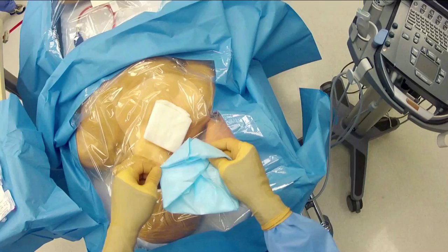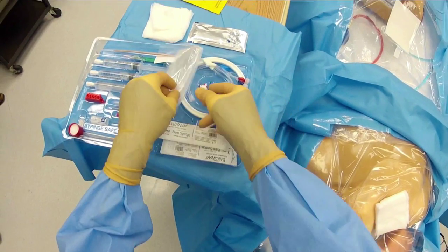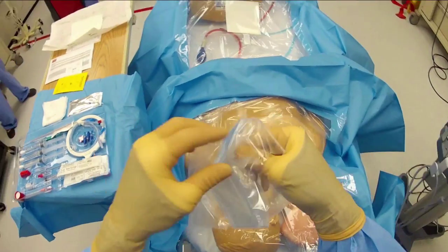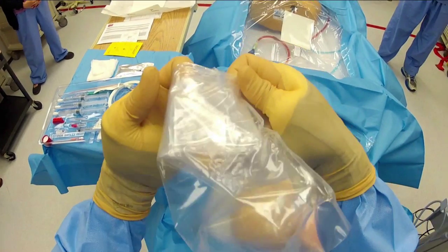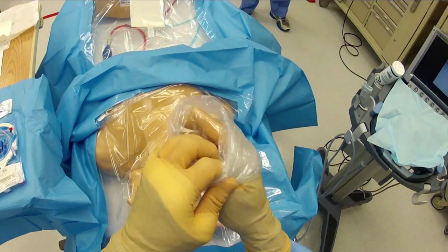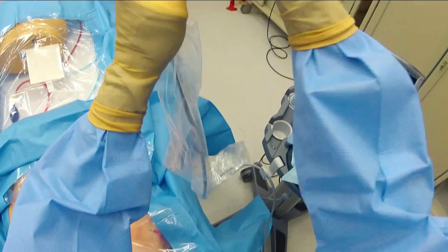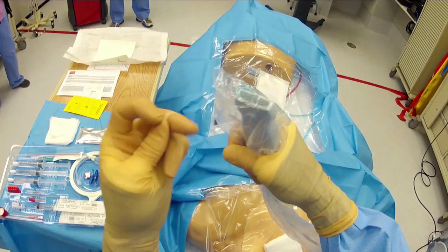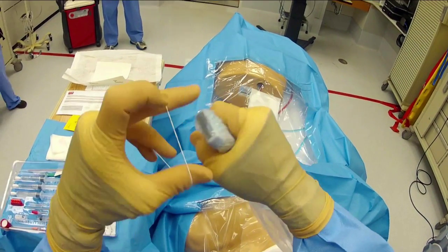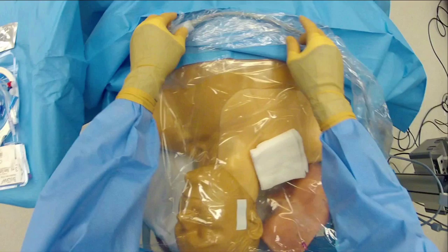We're now going to place the sterile sheet on the probe. We'll open up the wrapping — this wrapping is sterile so we'll use it as a keyboard cover so we can clip images during our procedure. We take the sheet, which is a plastic sock, stick our hand through the open end, and invert the sheet over our dominant hand. The probe has already been prepped and is in the holder with some non-sterile gel. We grab the probe and unfurl the sheet over the cord, secure it at the top, and place the rubber bands to hold the sheet in place with the bundle of gel at the top. We smooth out any air bubbles and secure the sheet, then place it in our sterile field.